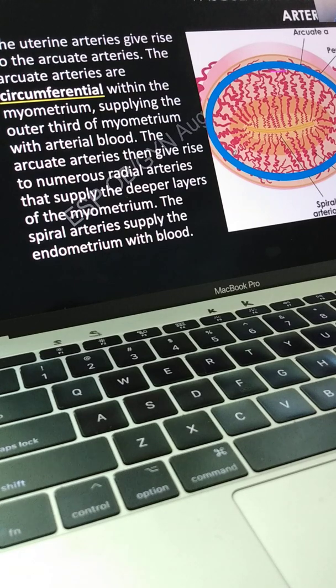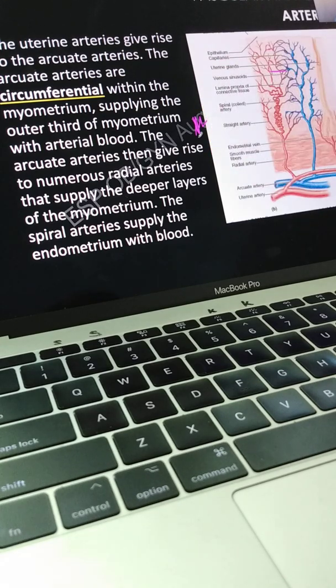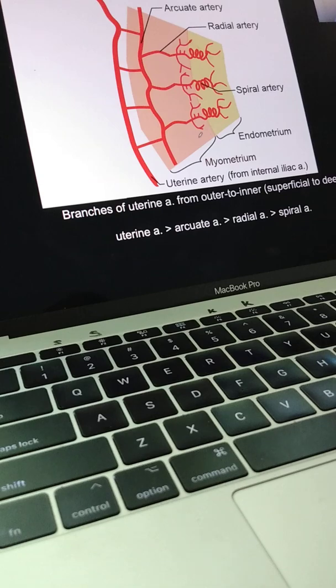So we put color Doppler on, we're going to see one uterine artery on either side. You can't really see them here. Okay, there's one over here. But those are the arcuate arteries. You're not going to have this exact diagram on your test, but if you understand this diagram, you do well in these questions. So this tells us where the vessels are coming from and where they're going.